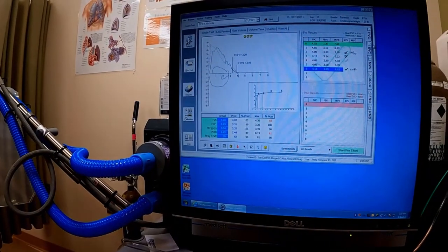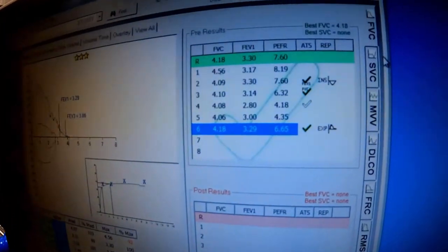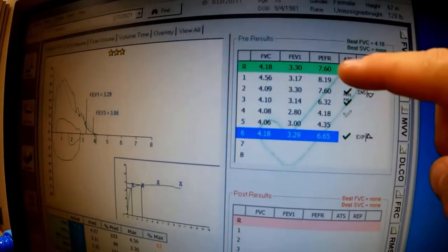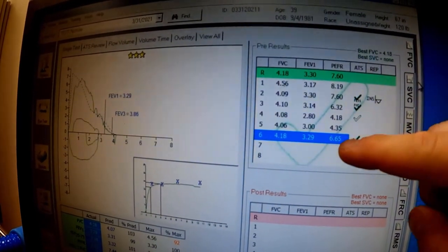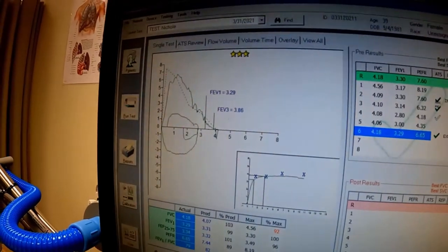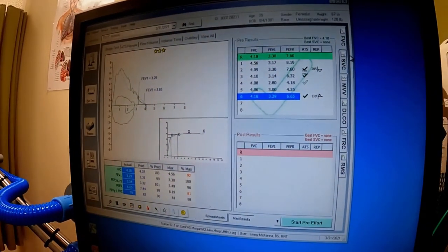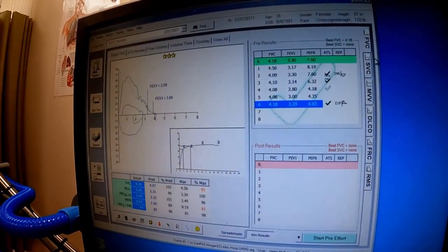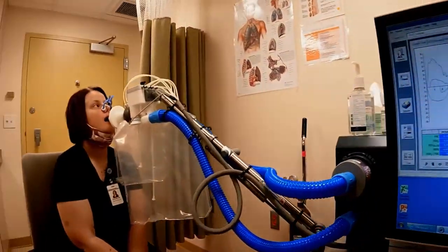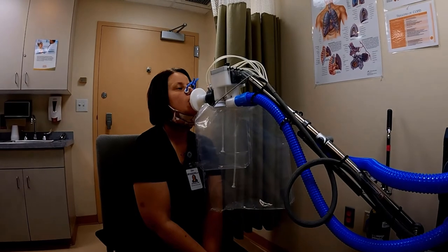Okay, so we're going to do this forced vital capacity. We already have some numbers here, as you can see. She's already met it on these three dark check marks. We actually have a full check mark, so we have three reproducible. And we're going to do one more with Nicole here, with me coaching her how to go through this. All right, are you ready? Uh-huh. So, Nicole, you're going to breathe normal.